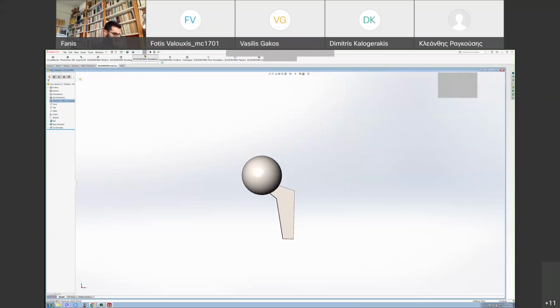Also, something to note, one reason we're not using the 3D models you created from the CT scan to perform finite element analysis is that usually because they have imperfections and the meshing is pretty complicated because there are many different surfaces, difficult model, and it takes a lot of time and a lot of processing power for these programs to analyze the stresses and the strains on such a model. When you do a simpler geometrical model that, you know, that are flat faces, this is just a sphere, it's usually a lot faster.